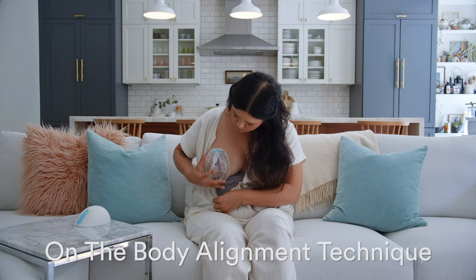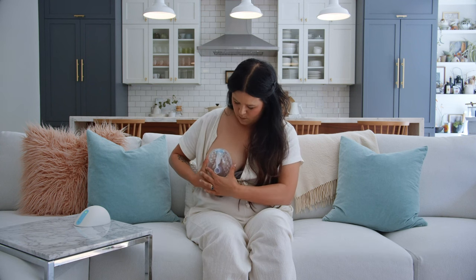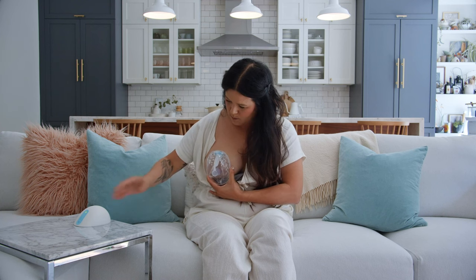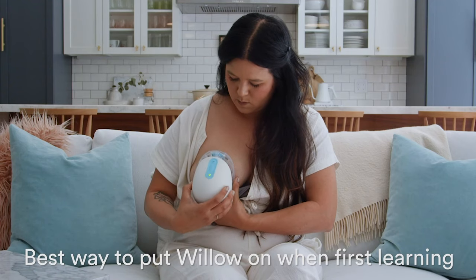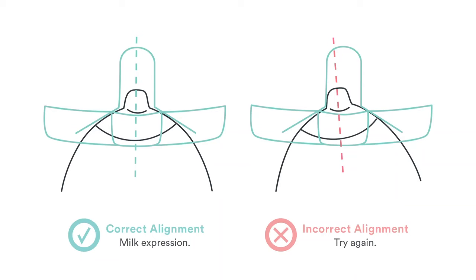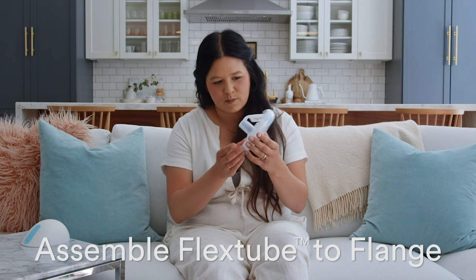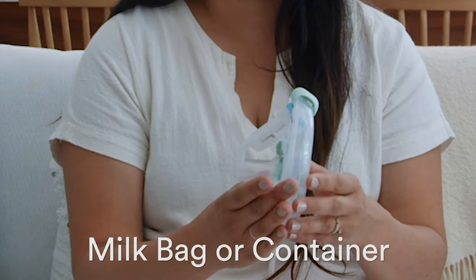To pump with Willow, first you need to put the flange or container on your body and confirm your nipple is centered in the insert or flange tunnel. Then attach Willow to the flange or container. We recommend using our on-the-body alignment technique so you can see if your nipple is centered, especially when you're first learning to use Willow. First, make sure you've assembled your flex tube to your flange and milk bag or to your milk container.